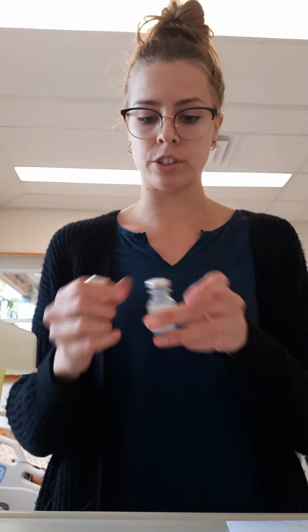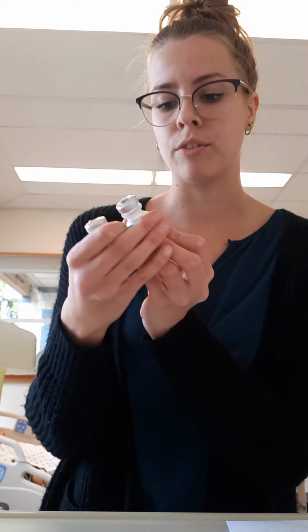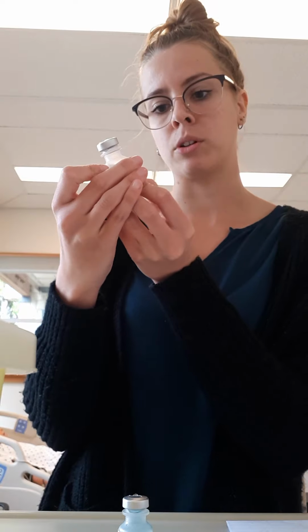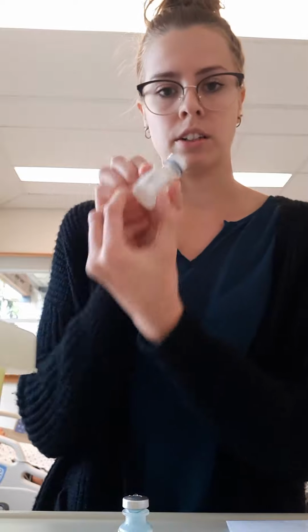So I'm going to put that off to the side and try and give myself more space here. So to begin, I'm going to do some hand hygiene. And I'm going to take out my supplies. And upon doing that, I will do my first check of the Naloxone and the sodium chloride. So I have Naloxone 0.4 milligrams per mL, which is what is in my vial, and it does not expire until 2035. And then I have sodium chloride 0.9%, 10 mL, and it does not expire until 2022. So that's my first check.